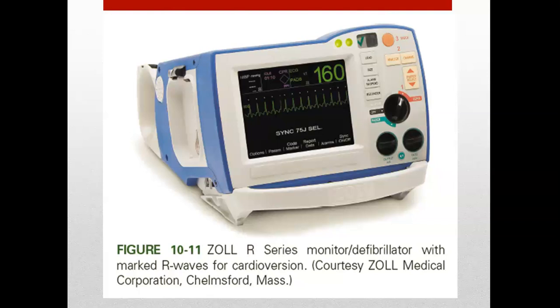Firing of the defibrillator can be a little odd, but the person who's operating the device when they're shocking has to press and hold the discharge button until the machine discharges, which can take a couple of seconds until the device kind of figures out where it needs to fire.